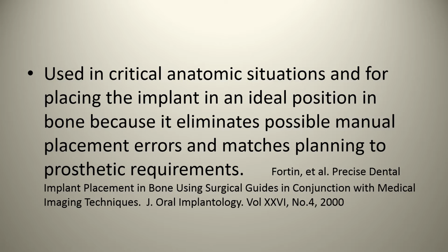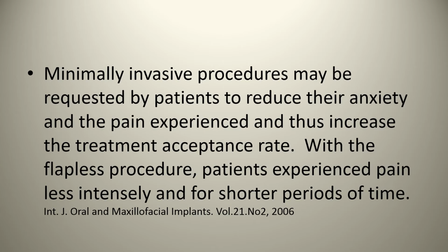Going a little bit more recently, in 2006, when we started talking about flapless procedures, one of the things that cone beam CT did offer was minimally invasive procedures, which may be requested by patients to reduce their anxiety and the pain experienced, the morbidity associated with implant surgery, and thus increased treatment acceptance rate. With the flapless procedure, patients experienced pain in lesser intensity and for shorter periods of time. There's also the issue that with flapless, you're reducing the lack of blood supply to the periosteum, and as such, you're no longer compromising the blood supply to bone.